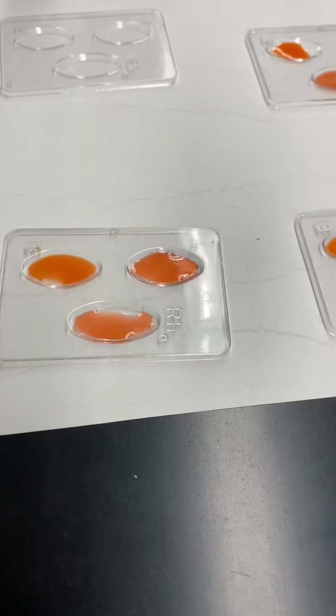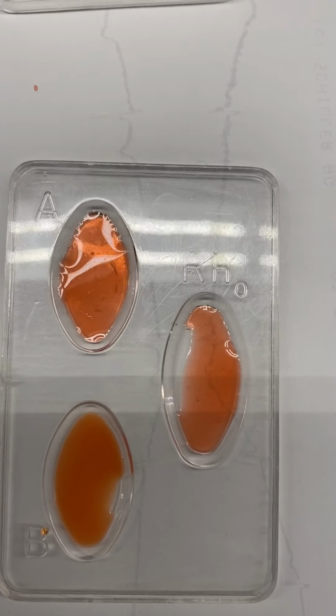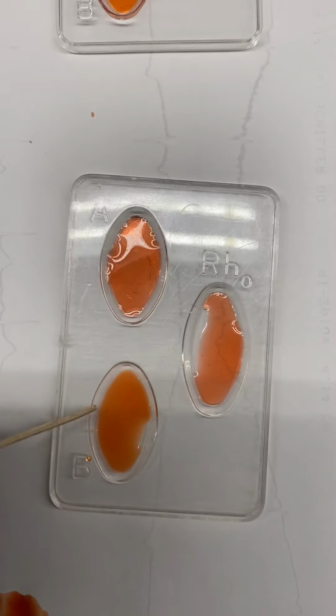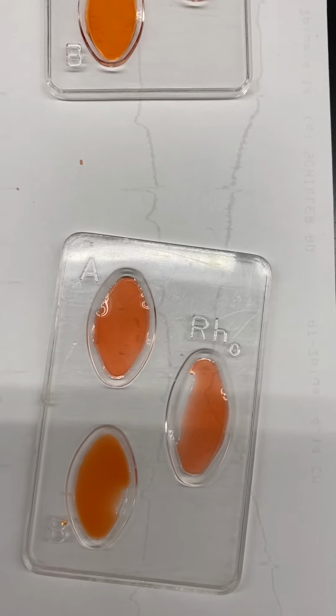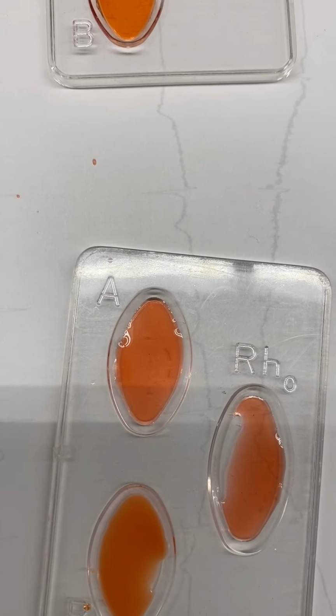So let's take a closer look. So here is our first sample. Again, look in this sample, you have kind of a cloudiness in the sample. And then on the top one, you can see some small structures being formed.